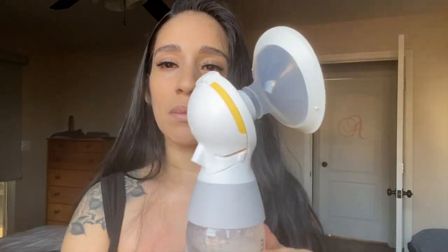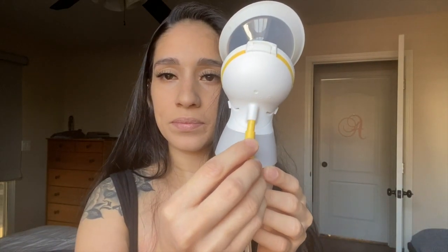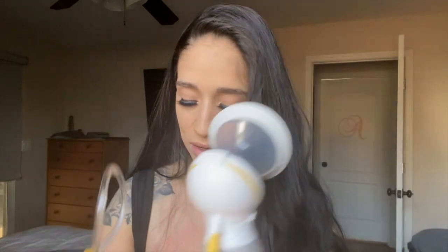This is what one of the pieces looks like, and you pretty much just insert the tube here. I pump one side at a time, so I usually just loop the other one back in, and then the other side gets put into the back of this — I'll go ahead and show you guys right now.